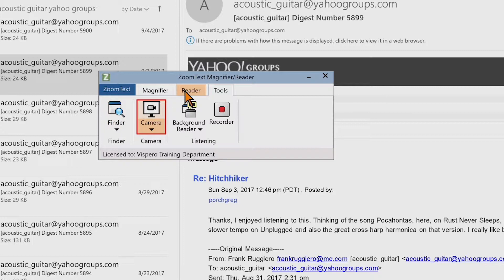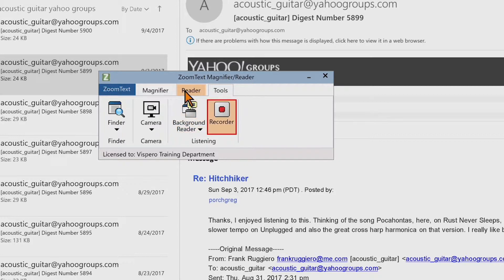The Camera group box Camera button access key is Alt-T, C. The Listening group box Background Reader button access key is Alt-T, B. The Recorder button access key is Alt-T, D. The ZoomText menu button access key is Alt-Z.